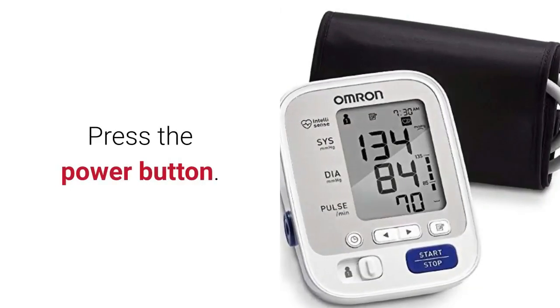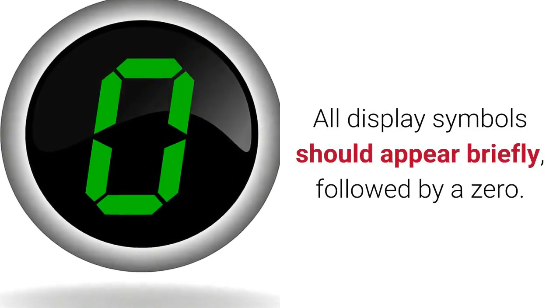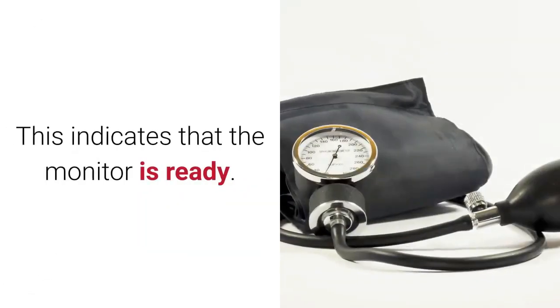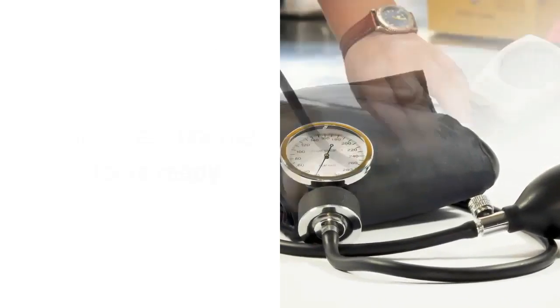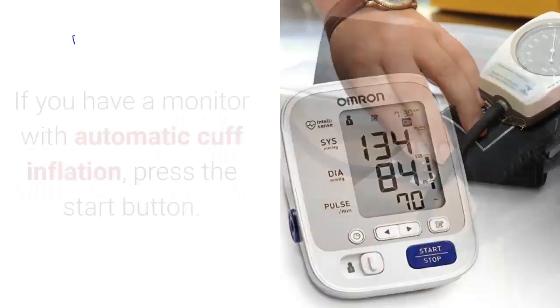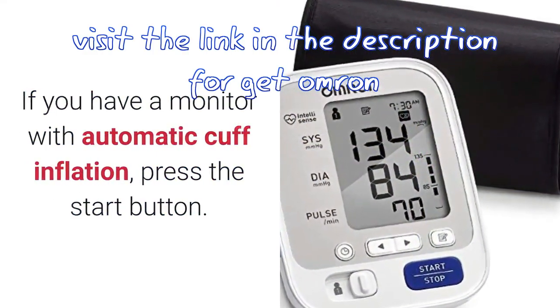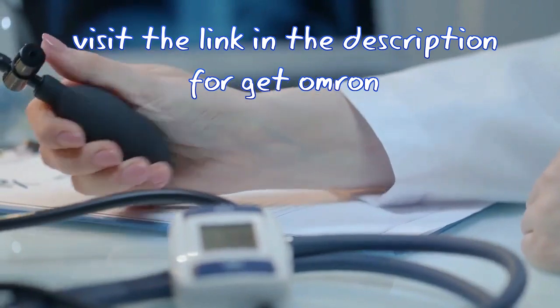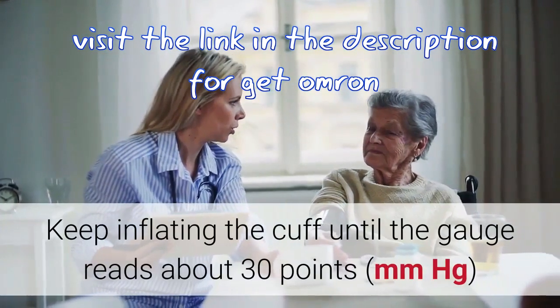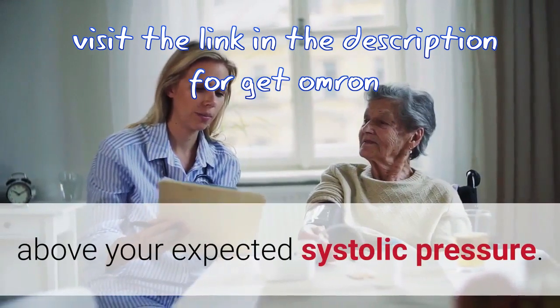For a digital monitor: hold the bulb in your right hand and press the power button. All display symbols should appear briefly, followed by a zero — this indicates the monitor is ready. Inflate the cuff by squeezing the bulb with your right hand. If you have a monitor with automatic cuff inflation, press the start button. Watch the gauge and keep inflating until it reads about 30 points mmHg above your expected systolic pressure.